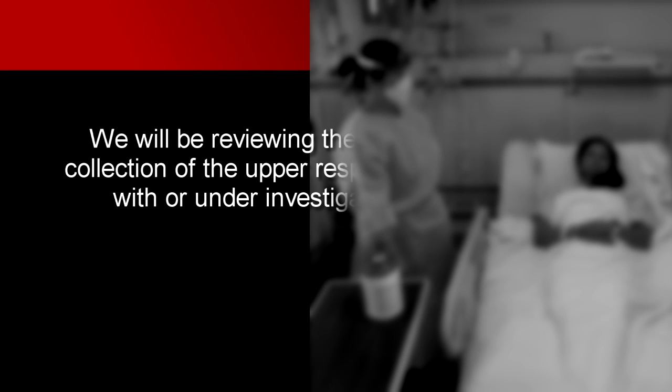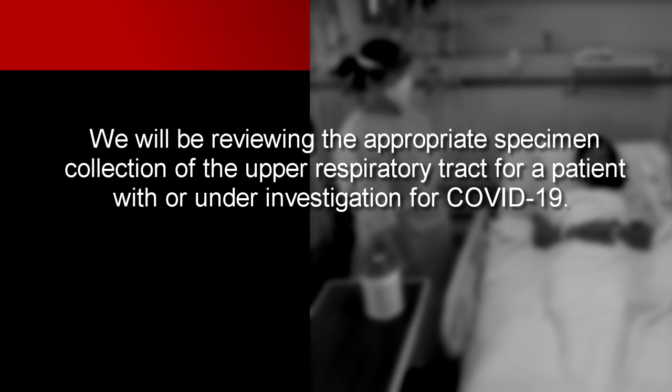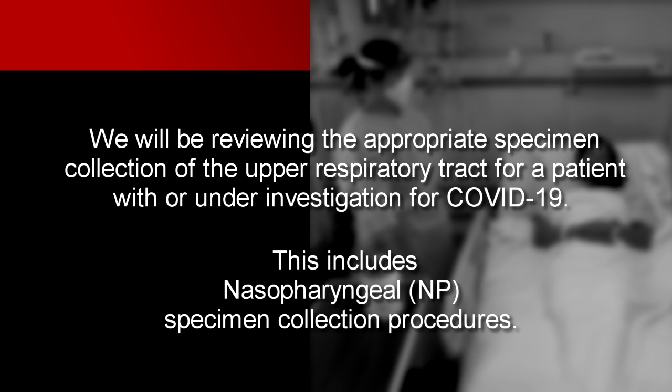We will be reviewing the appropriate specimen collection of the upper respiratory tract for a patient with or under investigation for COVID-19. This includes nasopharyngeal or NP specimen collection procedures.